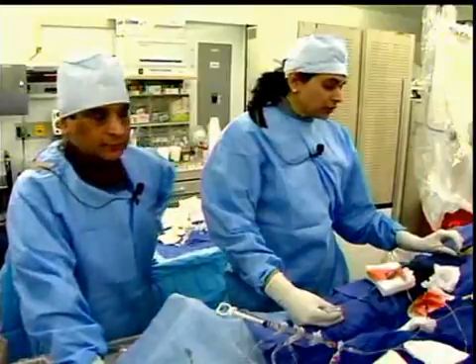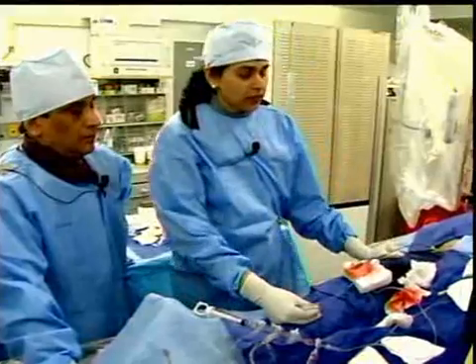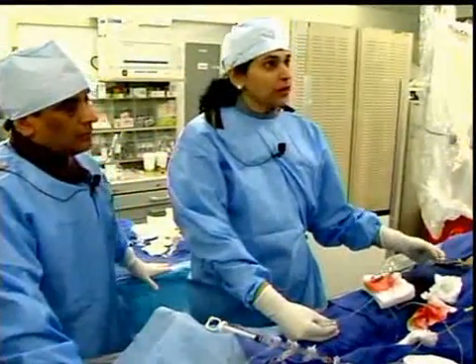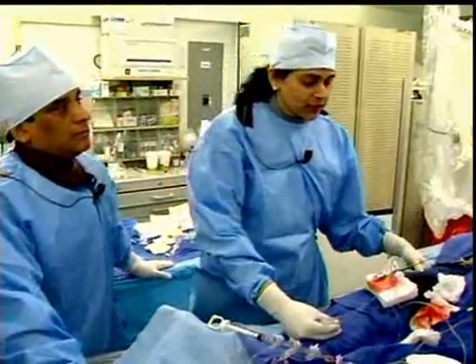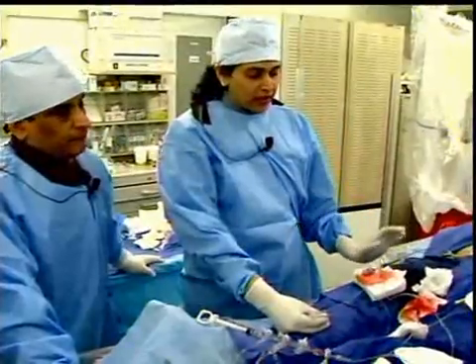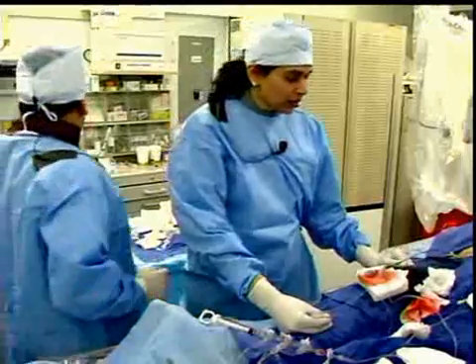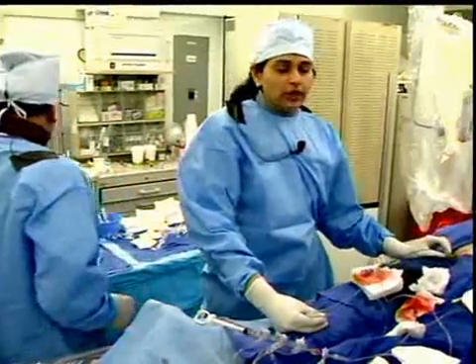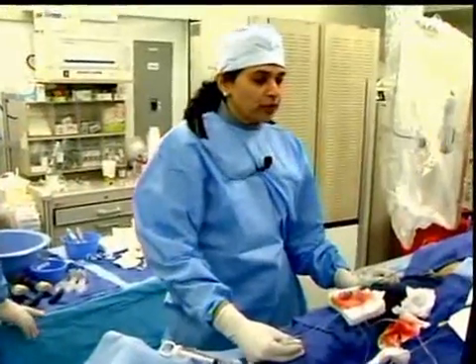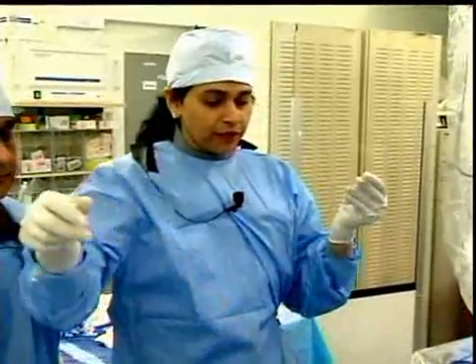Yeah, we have a 6 French sheath in the right groin and a 5 French on the left side. That is if you need a contralateral injection when we are doing the circumflex. And there will always be an issue whether you need to go with the 7 French. Ideally, in our institution, in the majority of cases, unless we are planning a bifurcation stenting, we do most of the cases with the 6 French sheath, and we have a long 45 centimeter Terumo sheath, which is the choice of most of the attendings in this lab. It gives a very good support in this kind of tough cases.